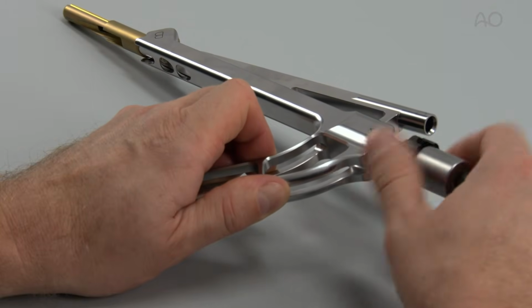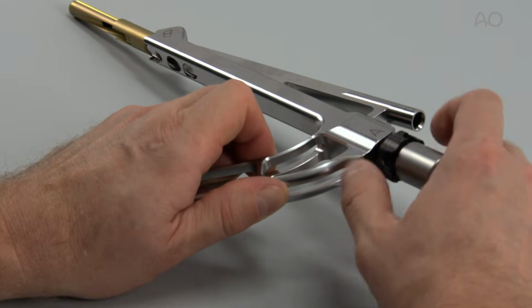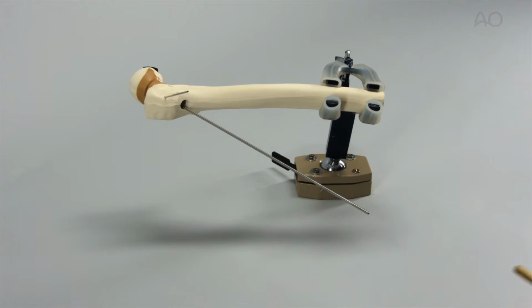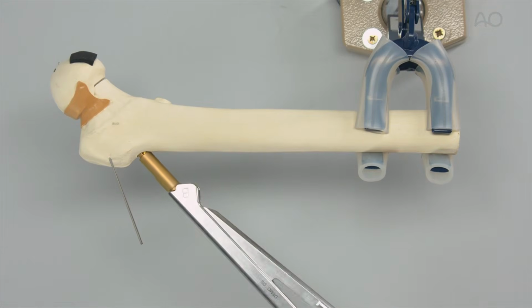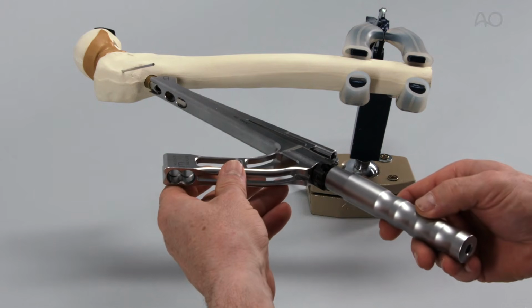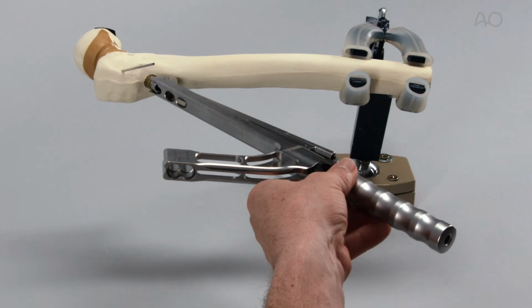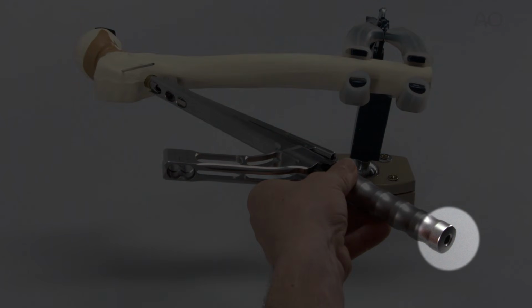Observe that the implant must be correctly fixed to the insertion instrument and that the bolt is in the completely extended position. The assembly is passed over the central guide wire and inserted into the reamed hole with slight rotational movements. The cylinder can be used to manually tap the plate onto the bone if necessary. If additional tapping is required, a standard surgical hammer can be used to hammer directly onto the cylinder.